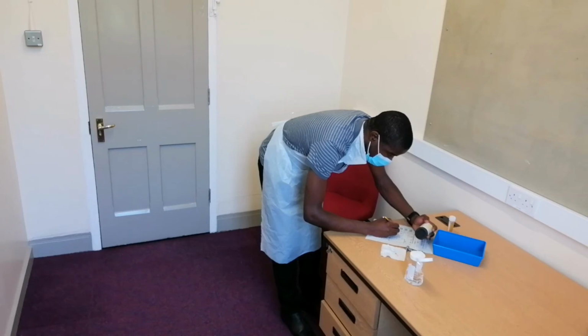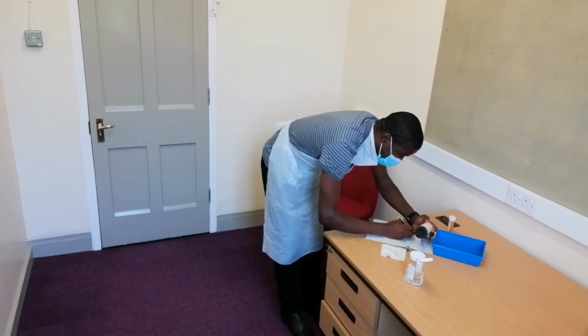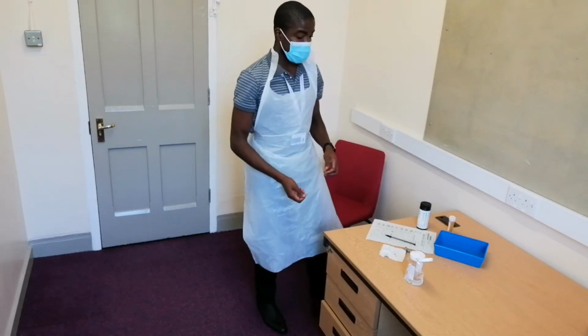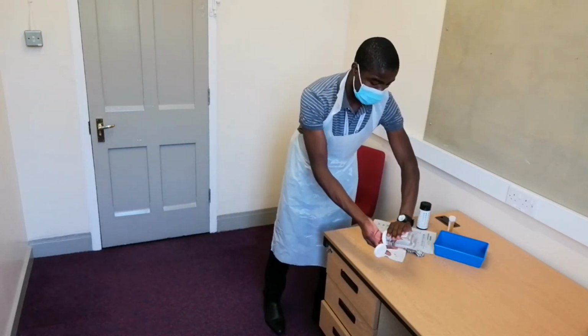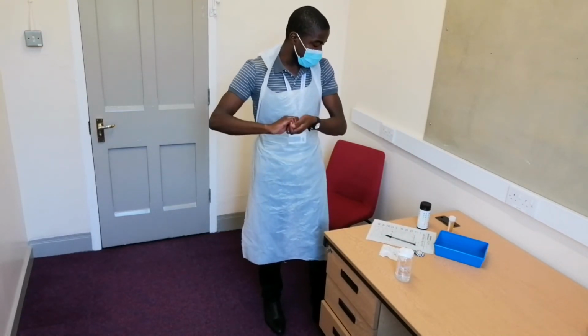Okay, and it is exactly 2 minutes. I read my leukocytes. Okay, now I'm done. Assessor, would you like me to leave the strip or I discard it? Yes, sir. Okay, thank you so much.